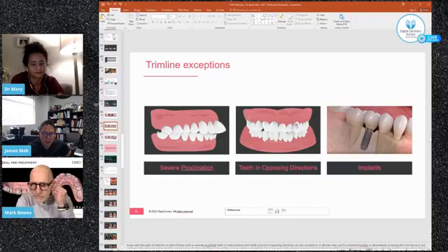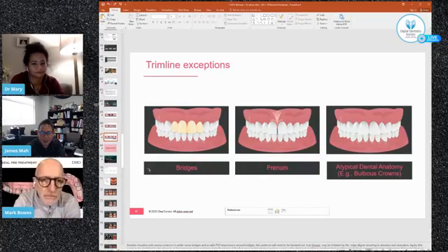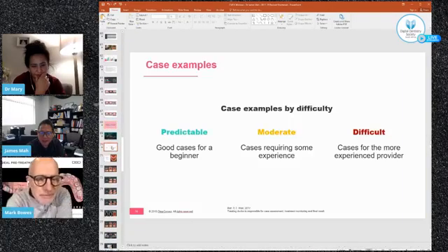Similarly, underneath the bridge, you have to make the technician aware of it. And it's not often apparent looking at the scan that that tooth is an implant, by the way. So the dentist needs to inform the patient of these types of situations where the trim line needs to be reduced to at least a straight line trim so that there's not too much retention. So I'll finish there, and then let's get into some of these cases.